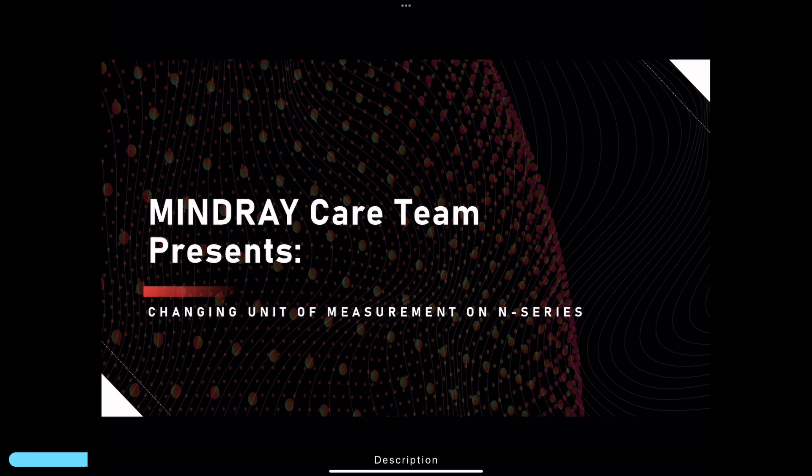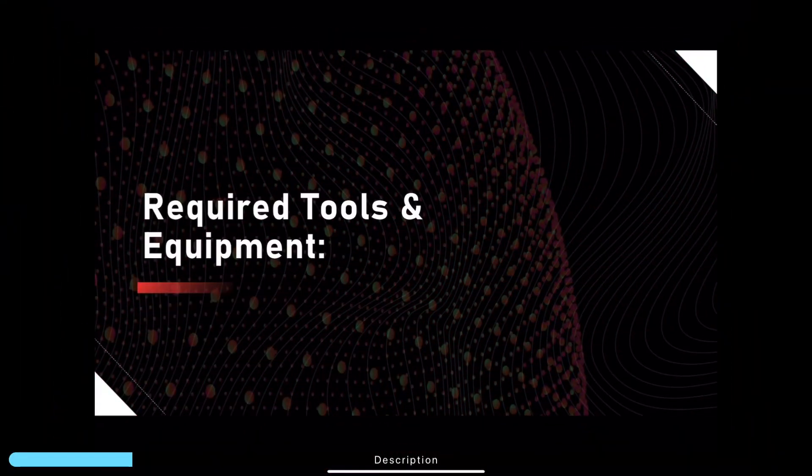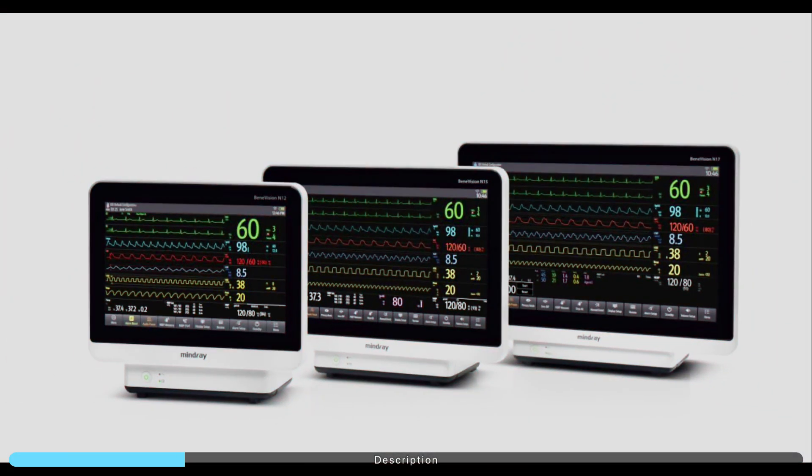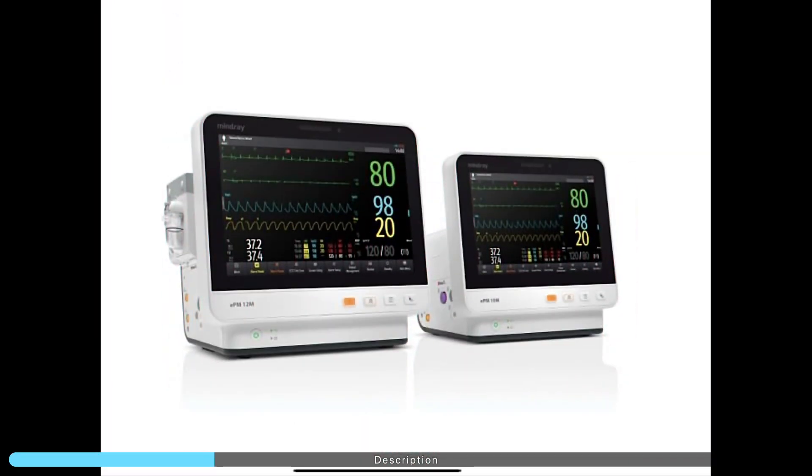Mindray care team presents: changing unit of measurements on N-series and EPM series monitors. For required tools and equipment, you will need either an N-series monitor or an EPM series monitor.